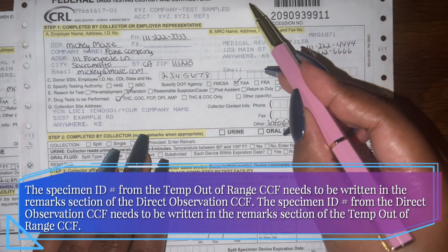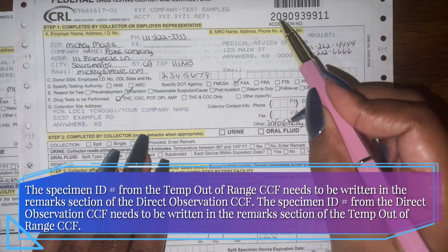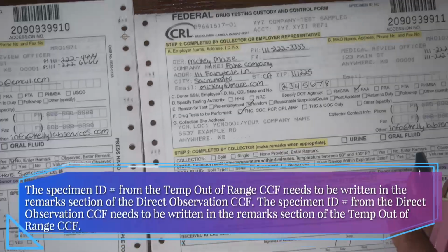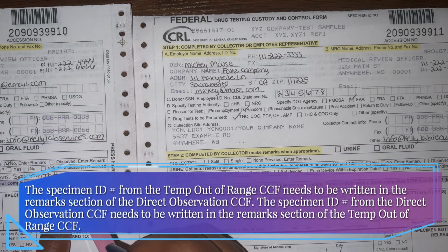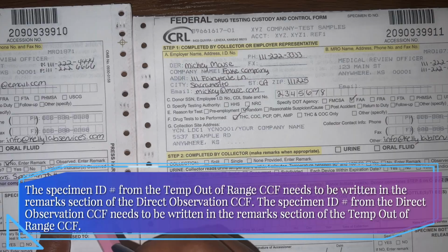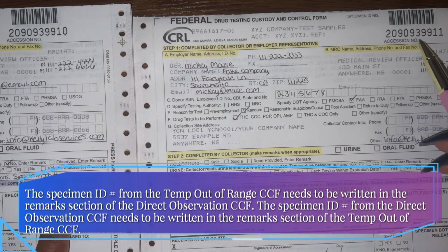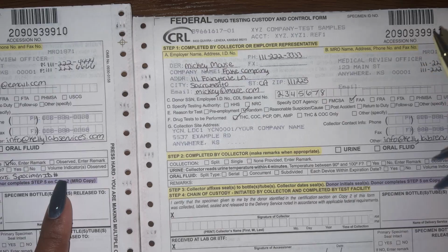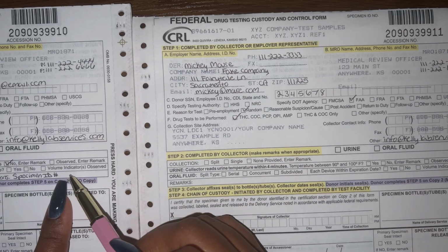We are going to take this specimen ID number from the top of this second CCF form, and we are going to write it in our remark section on our first CCF form, because we are telling them, hey, this specimen ID number on the direct observe form goes with this specimen that we're documenting for temp out of range.